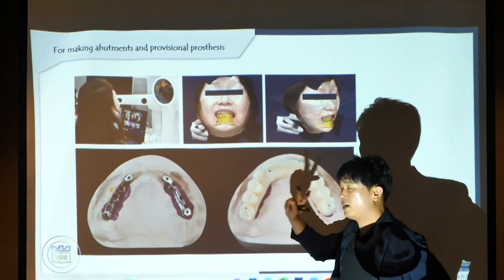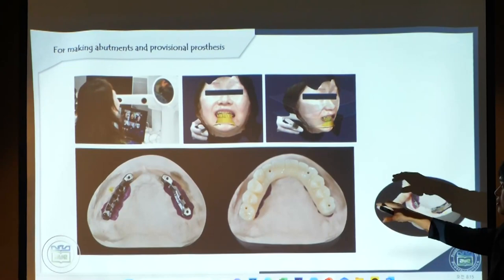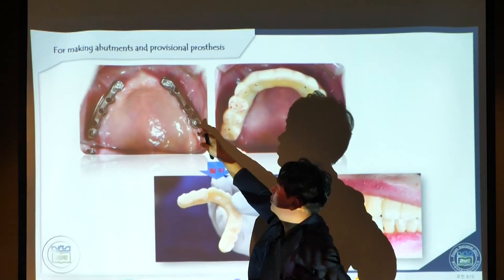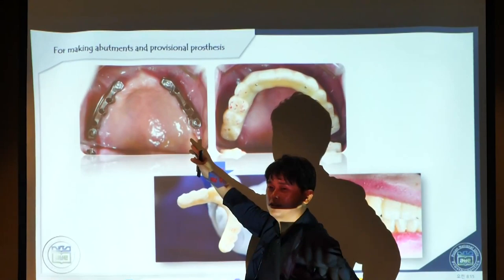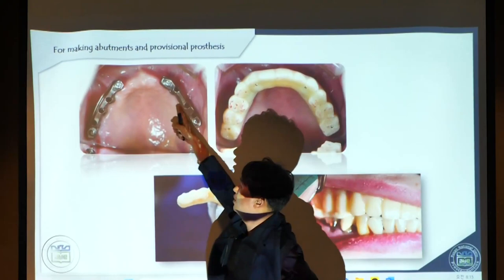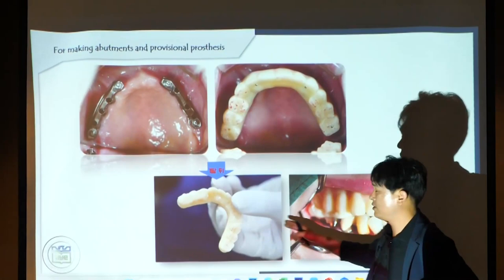At the second visit, I can get these two things, the abutment and the temporary, so I delivered them like this. These bar type abutments can be made by the IDA company. If the dentist inserts the implant in a strange position, it is very difficult to make the prosthesis, so we can use this kind of abutment. Then this is the temporary, and I adjusted the occlusion and checked it every month.